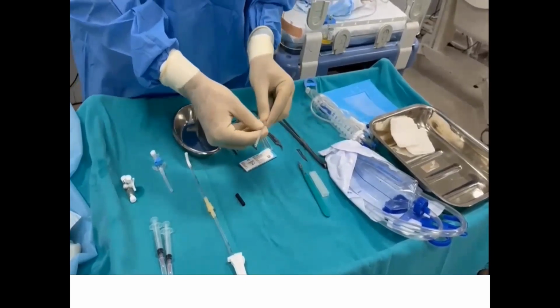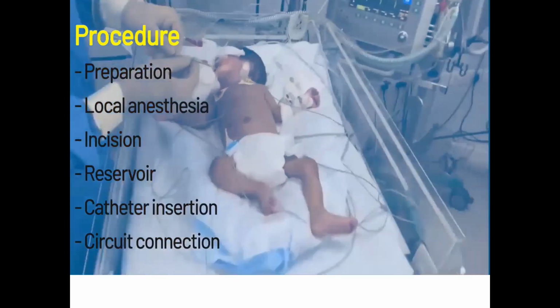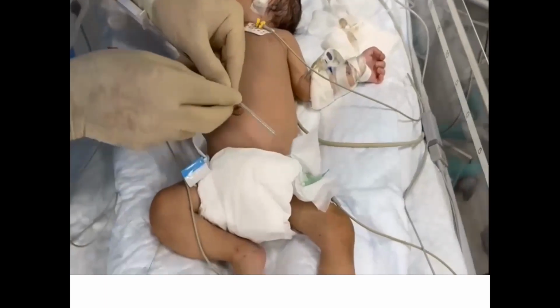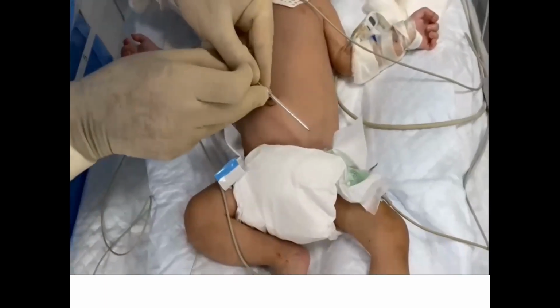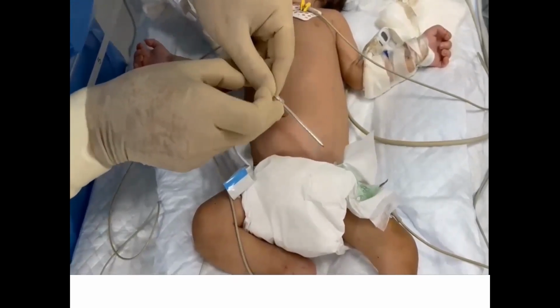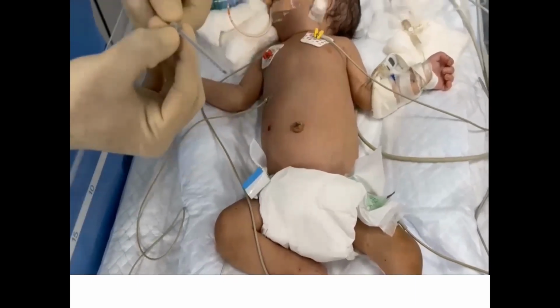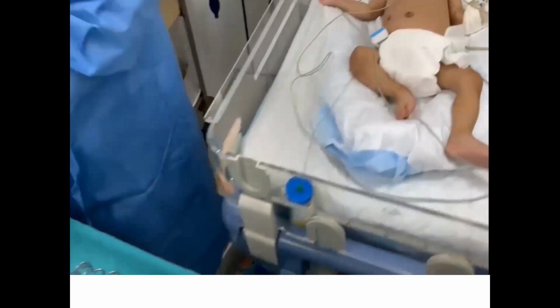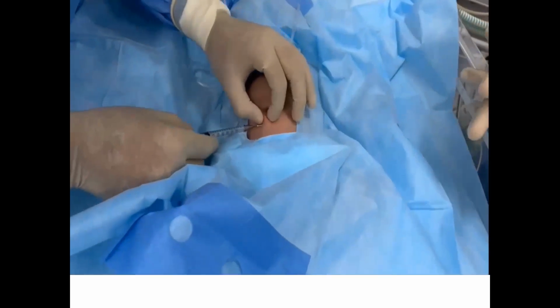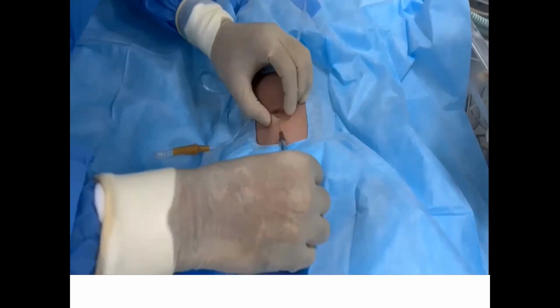For PD catheter placement, first we have to take an appropriate size of PD catheter. This can be modified as per the neonatal size. For measuring the depth of PD catheter insertion, we have to approximate the distance between the umbilicus and the anterior superior iliac spine. And then we have to adjust the guard of the PD catheter. After determining the length and depth of PD insertion, we have to infiltrate the site in which the PD catheter insertion is to be done.